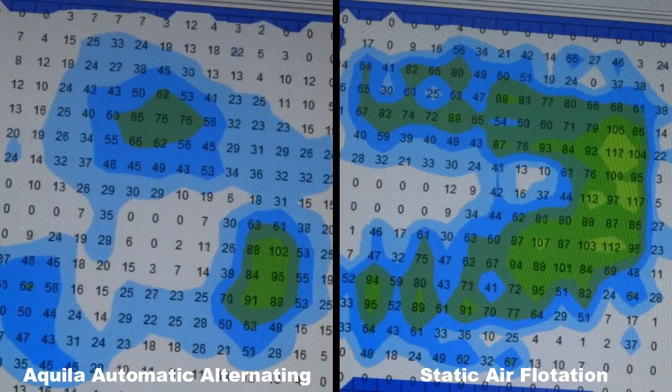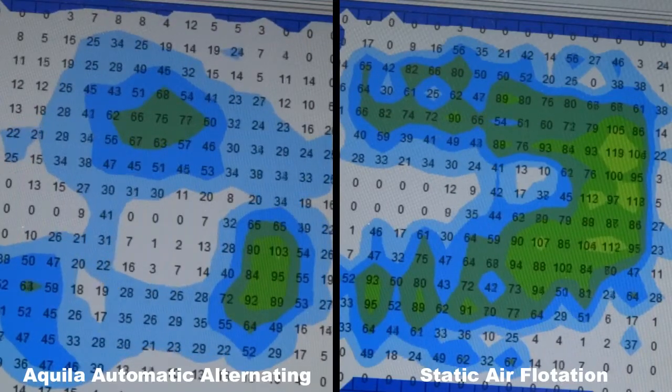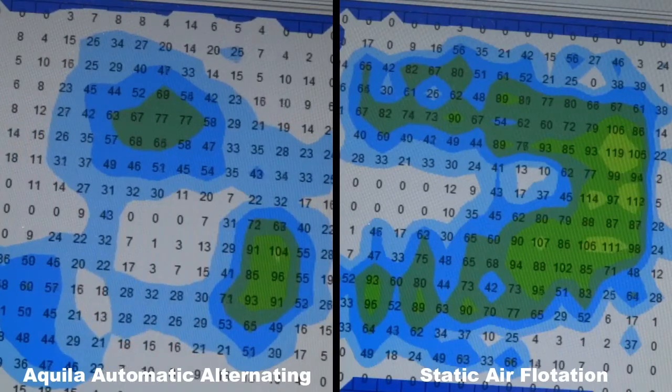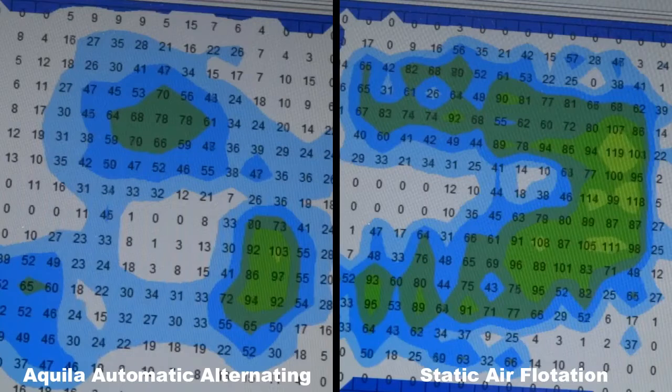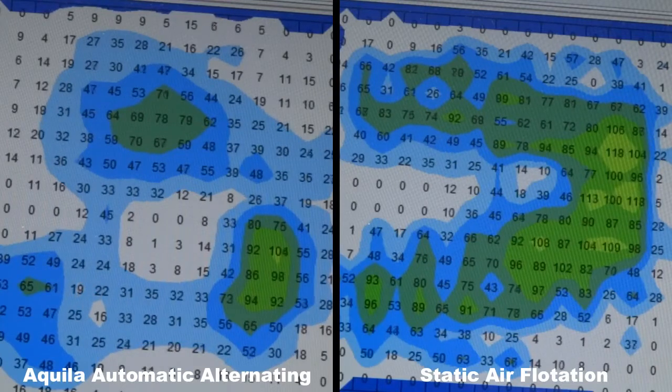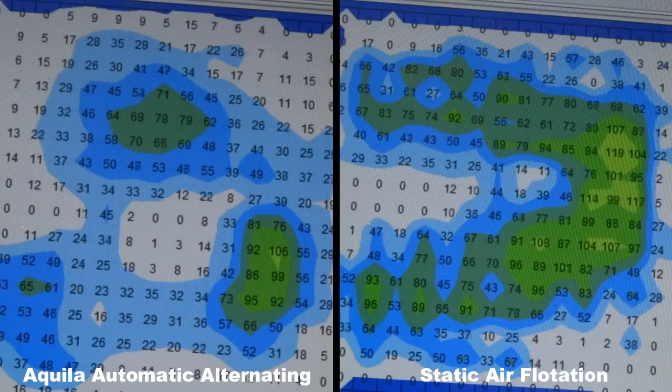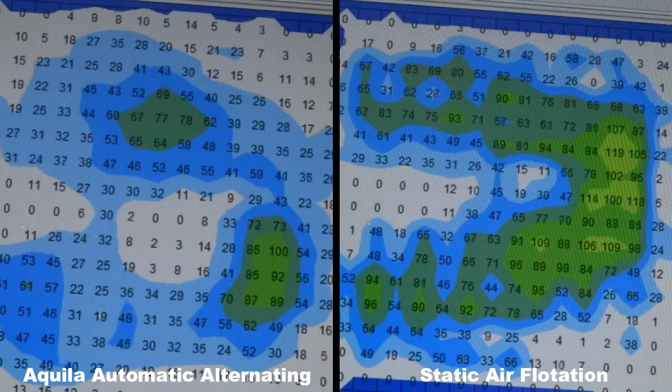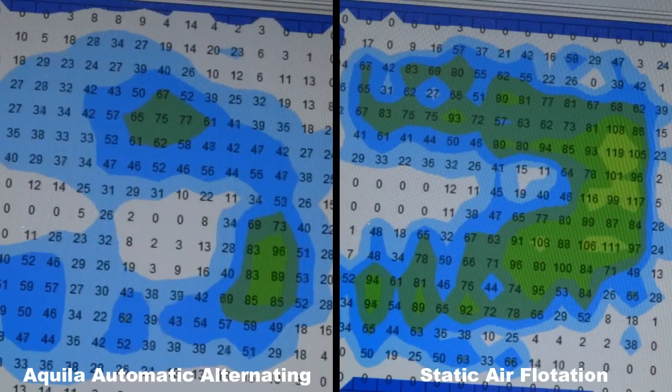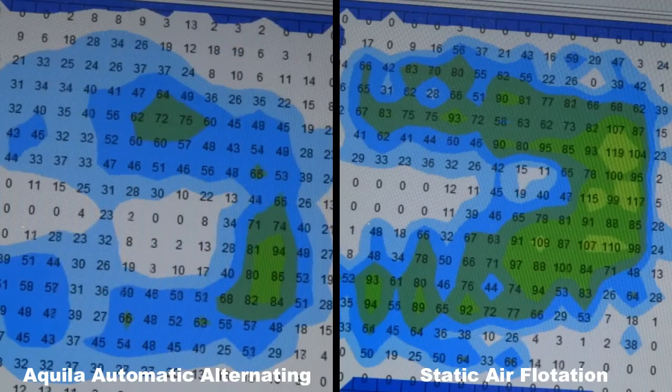The pressure mapping system we are using today is a calibrated FSA interface pressure mapping system. It is crucial that your system be properly calibrated or your findings will be inaccurate. Over the entire duration of this video, the pressure mapping system is running and capturing even the slightest change in the interface pressures that the cushions create on their own.